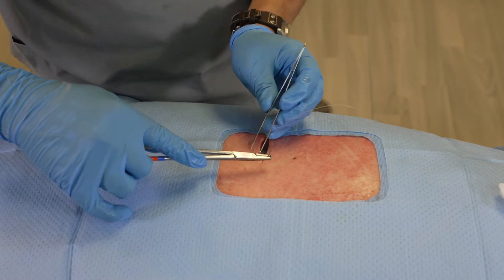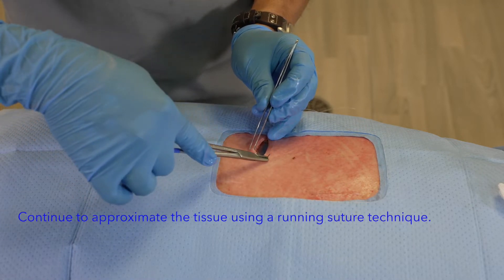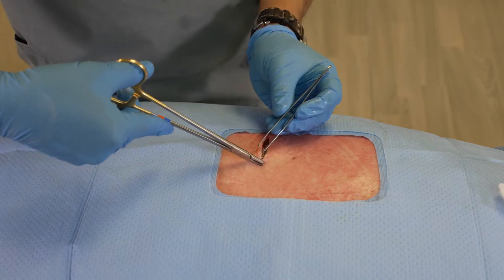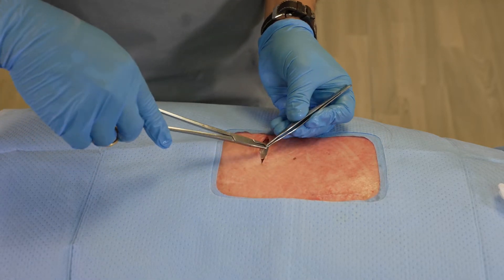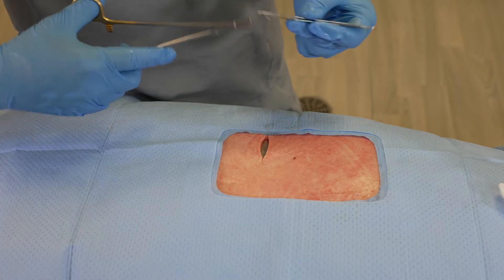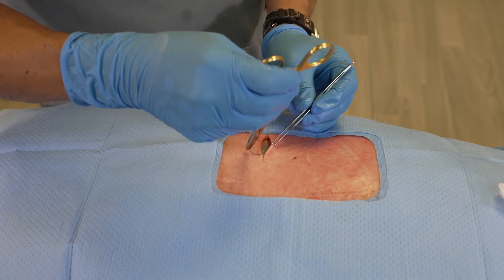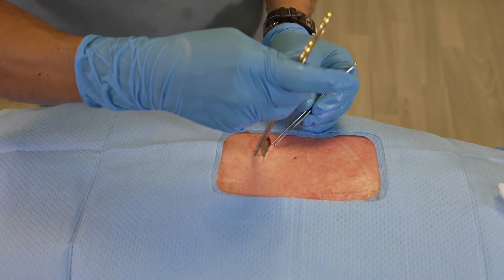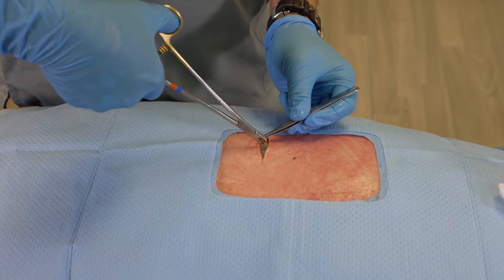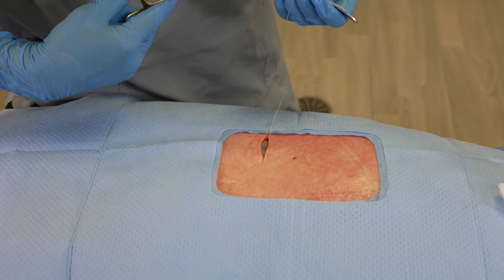Now we're going to start to run the suture at the same depth as we've done on the other side, and we're going to run the entire length of this wound. While the suture can cinch down very tightly, our goal is just to approximate the wound but not strangulate the tissue. If you pull too hard, it can actually induce necrosis, which we want to avoid.